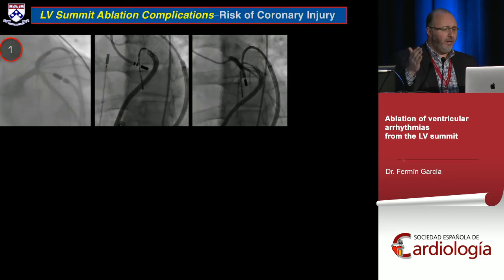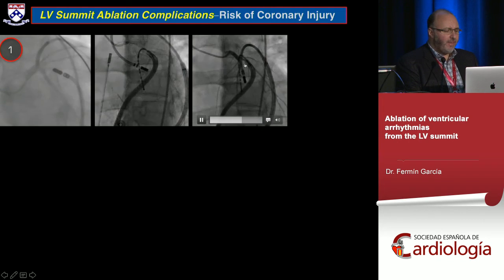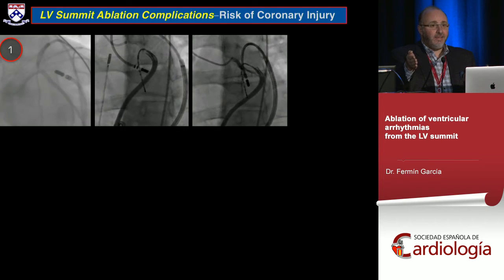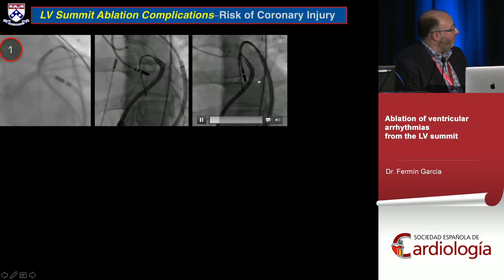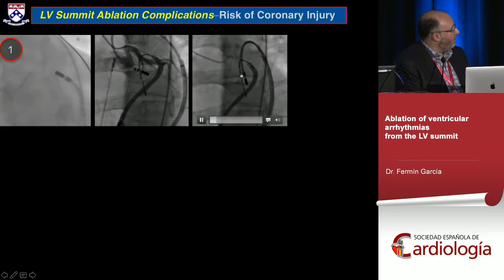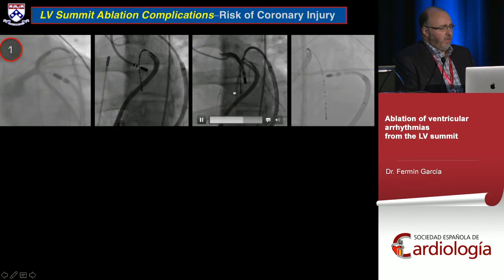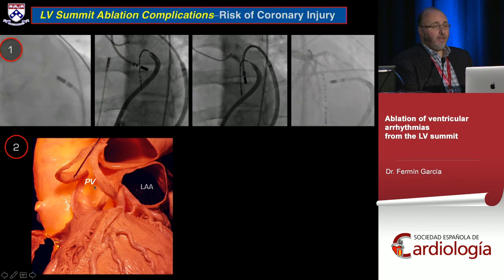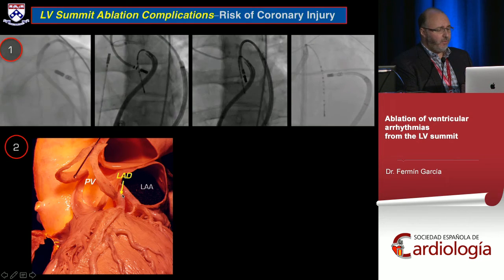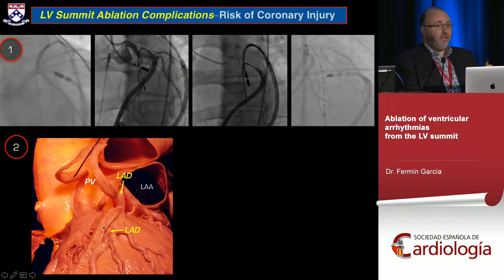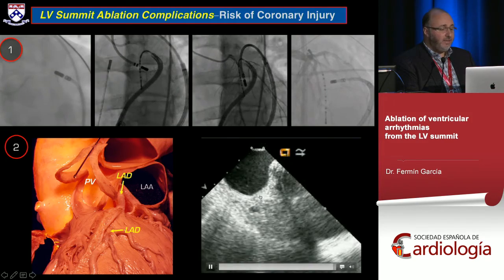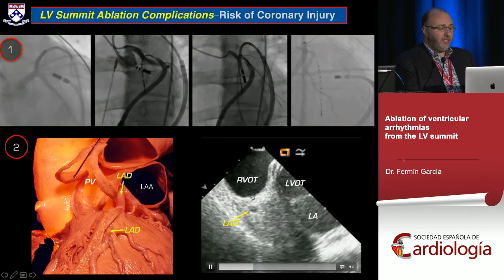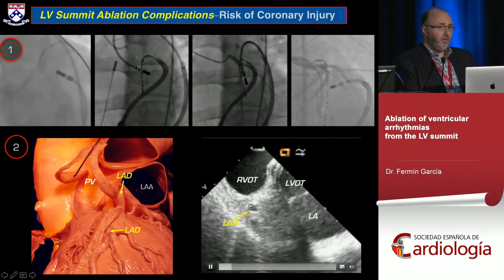When burning from the epi, you want the catheter parallel, not crossing toward the coronary. The decapolar catheter is very helpful once you define the relationship of the great cardiac vein and LAD — you stay on the side that doesn't have the LAD. Above the pulmonary valve, I'm very careful because the LAD runs through there. In the anterior RVOT, on ICE, you can see the RVOT here and the LAD very close — a powerful lesion there could damage the LAD.